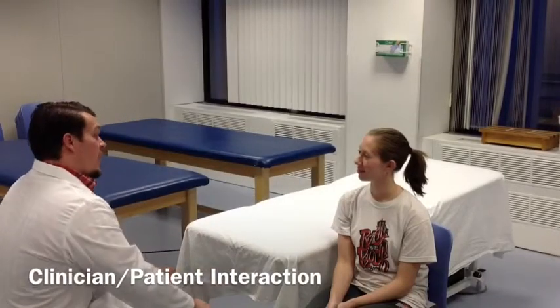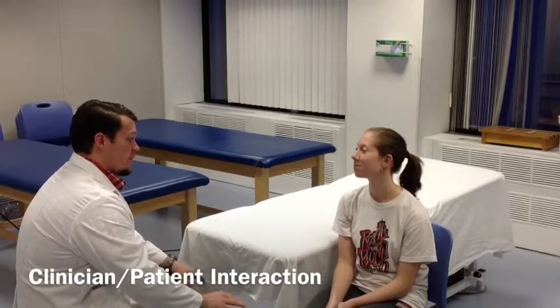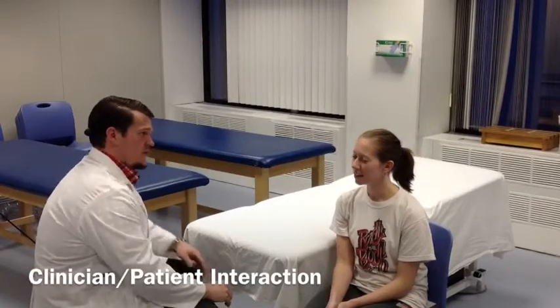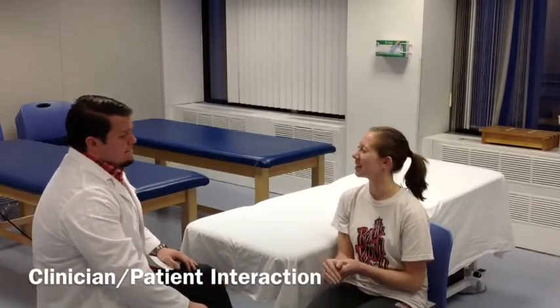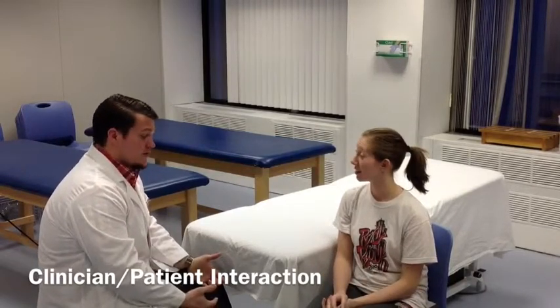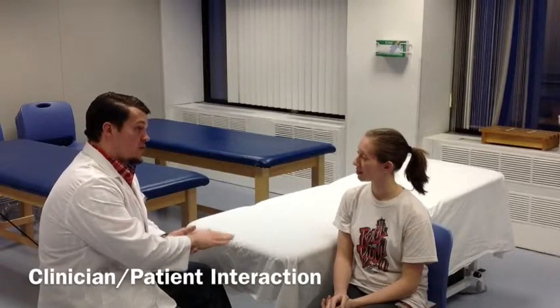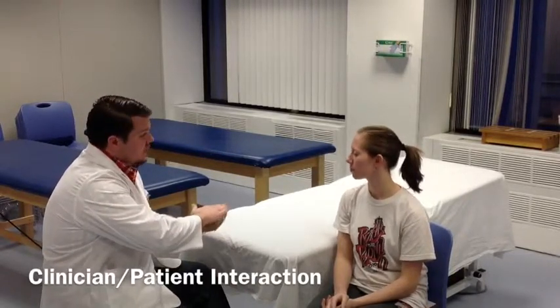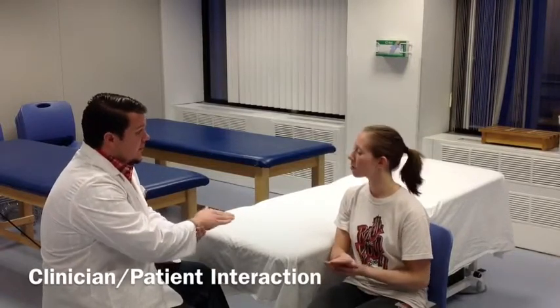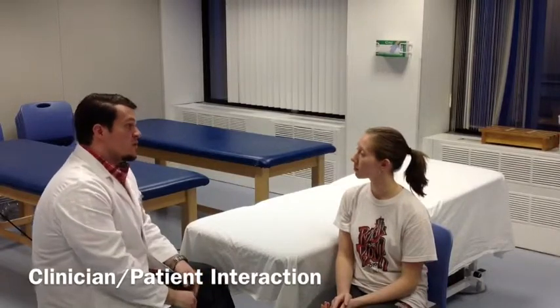Hi Amanda, my name is Adam, I'm your physical therapist. I know that you're in here today for some wrist pain, some tightness and soreness, is that correct? Yeah, it's been pretty tight, I'm not sure why. Okay, I'd like to start by checking a measurement of ulnar deviation, which is just you moving the outside of your hand toward the outside of your arm.